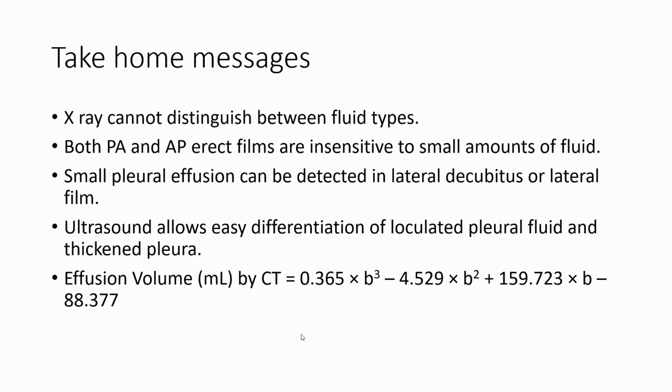Take home message: X-ray cannot distinguish between fluid types. Both PA and AP erect films are insensitive to small amounts of fluid. Small pleural effusion can be detected in the lateral decubitus or lateral view. Ultrasound allows easy differentiation of loculated pleural effusion and thickened pleura.